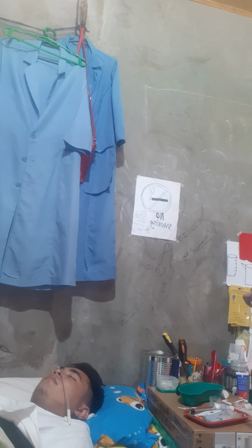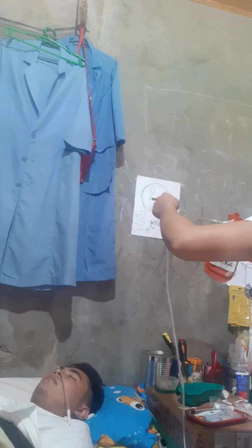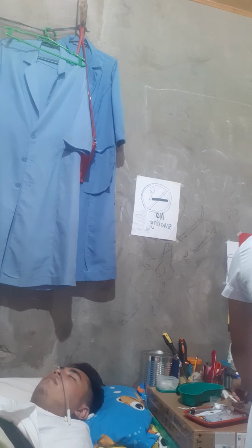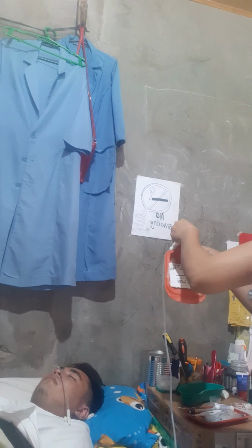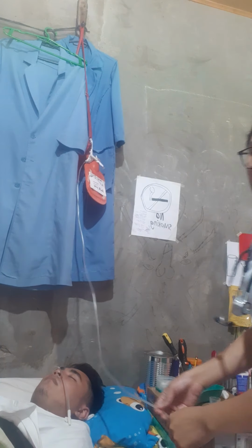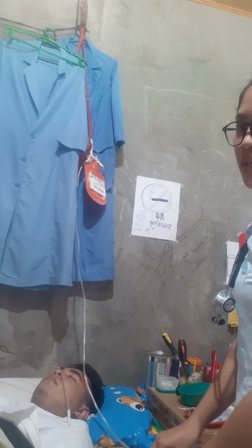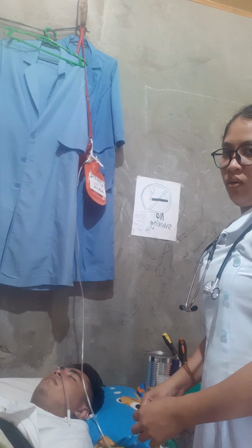Afterwards, close the clamp on the tubing, and we're going to hang it 30 centimeters or 12 inches above. Because at this height, the formula should run at a safe rate into the stomach or intestine.